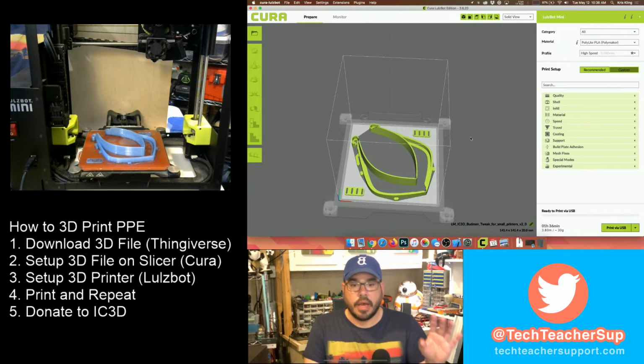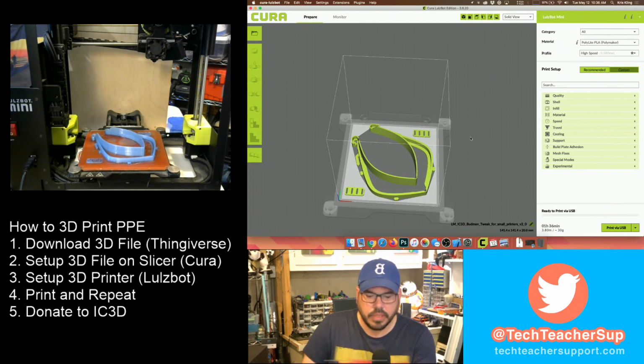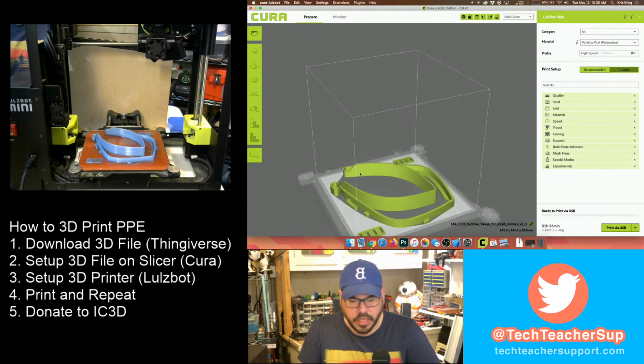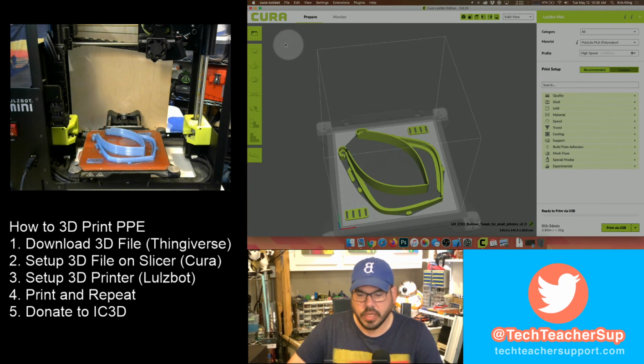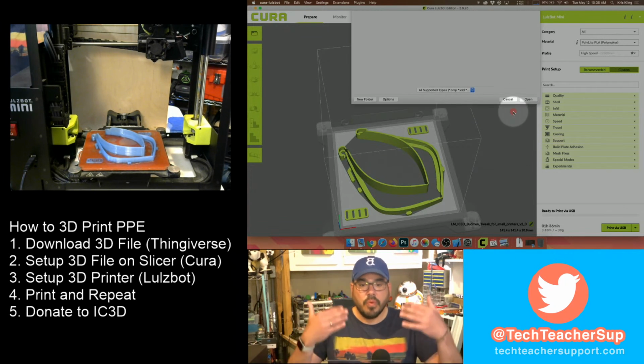All right. Now, I've skipped over a bunch of steps just to get you to this point. But this is the sort of setup of the slicer. So we were on step 2. And as you can see here, I have loaded both the headband in and the 2 straps. So to do that, I'm going to show you this. Watch my mouse here in the upper left. We're going to go over here and we're going to say Open File. And then we're going to find that headband and we're going to say Open. And that's how you import things into Cura.